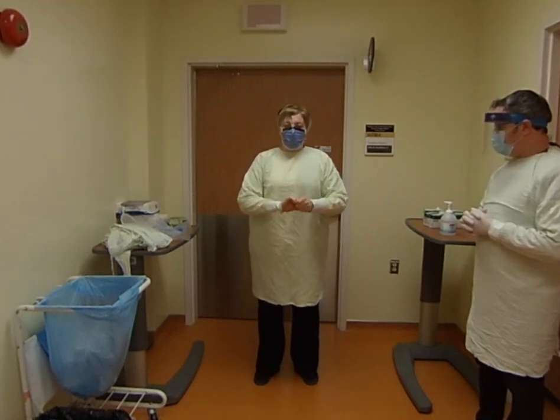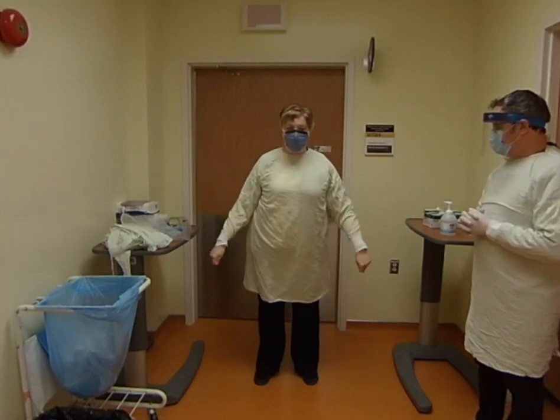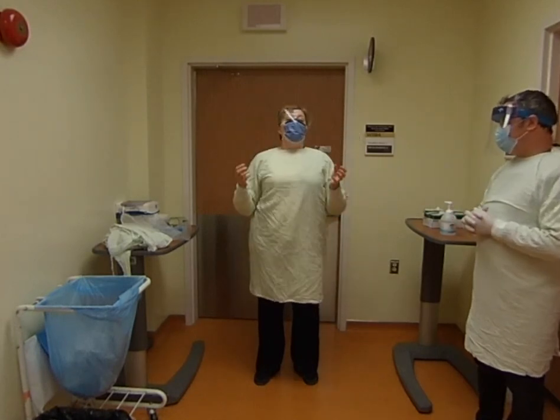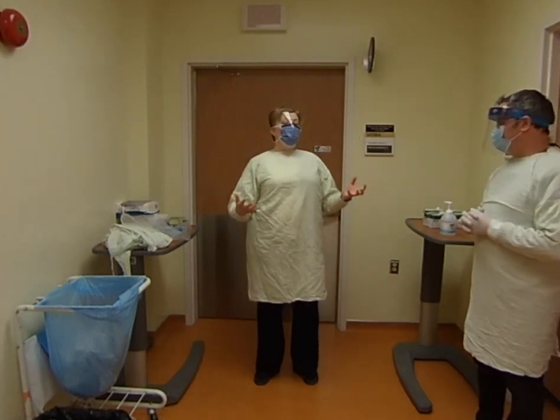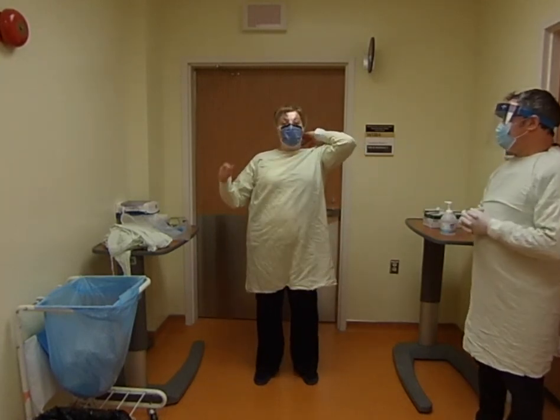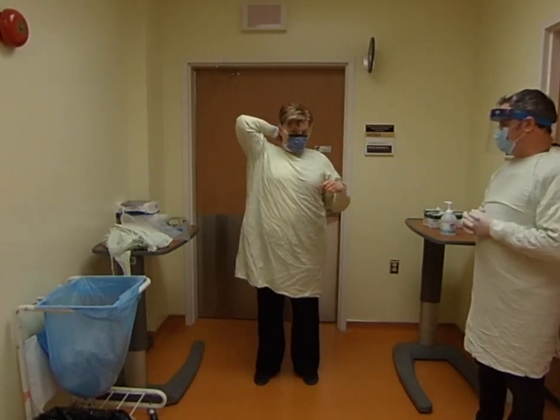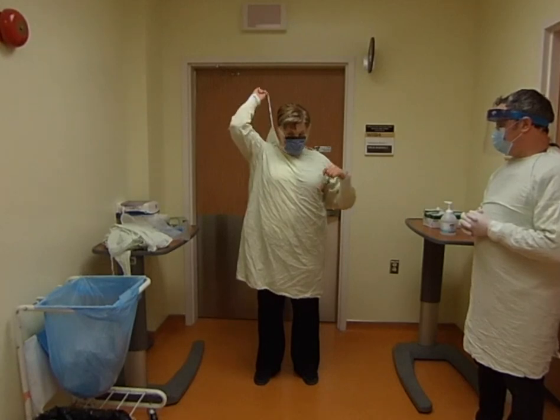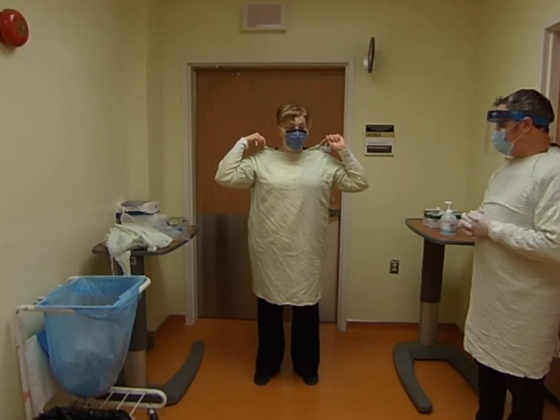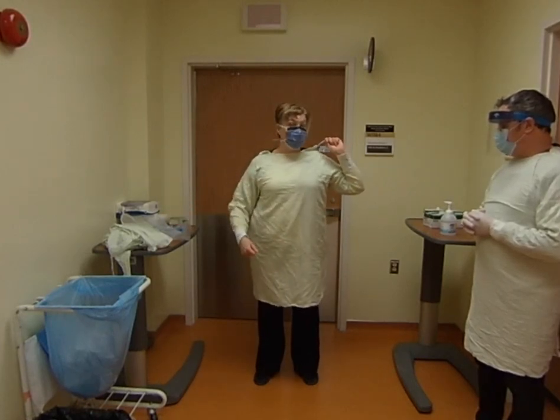Now you want to undo the waist strap first, then undo the top one. Why does the order matter? Because once you grab the top, you don't want to go back down — when you grab the top you're going to lean forward and start pulling it off. You want to untie the top in a bow, not a knot, and do this in a very slow and controlled manner. Don't just rip it off, because if there's anything wet on it, it could end up being spread elsewhere.